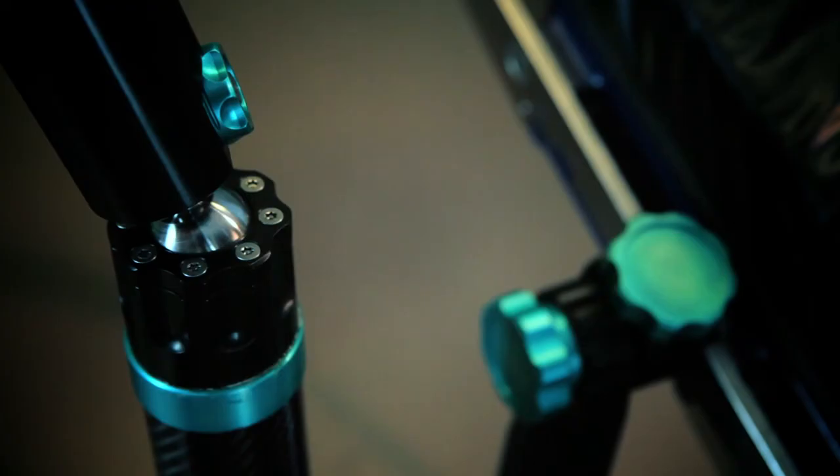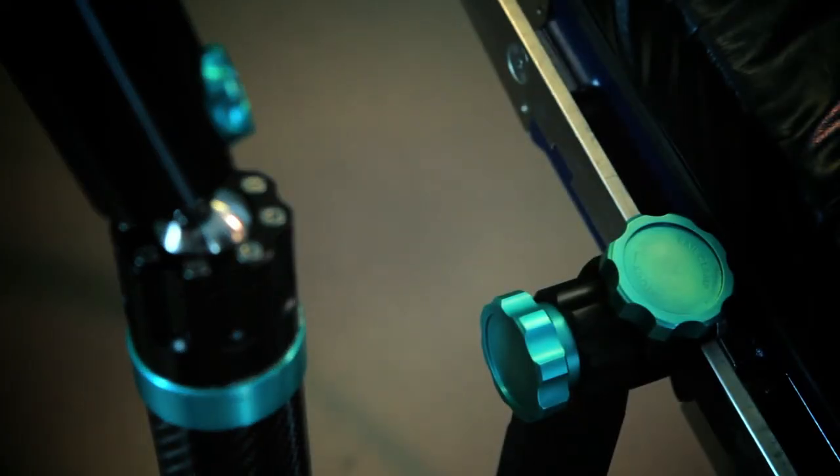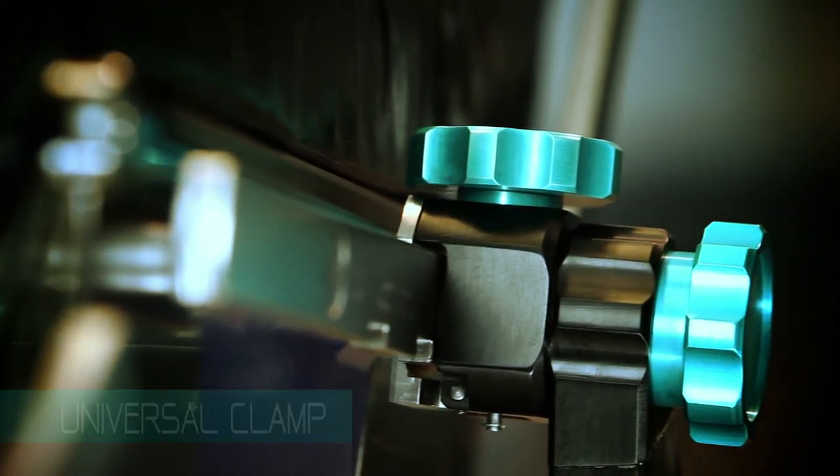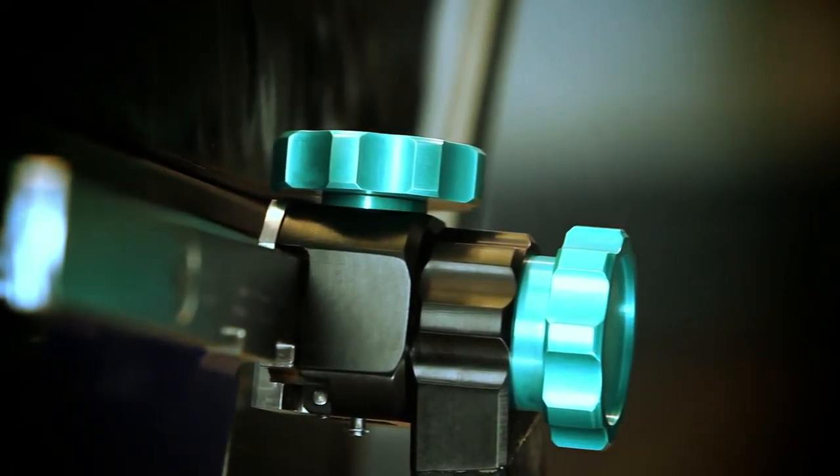The Assist Arm surgical limb positioner can be easily and securely attached to the rails of all types of surgical beds, with no need for additional adapters, wires, or batteries. All systems have been optimized to minimize setup time.